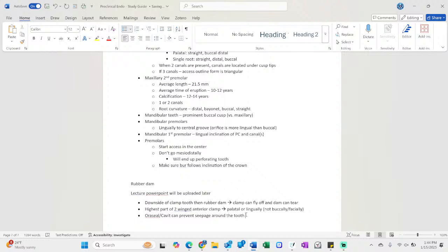So you can use Wedjets in difficult anatomical cases, if there's weird crowding, something like that, or sometimes in the anterior, if you're looking to isolate multiple teeth, or if it's a young person and their dentition's not fully formed yet, the height of contour on the tooth may still be a little bit covered up by the gingiva.